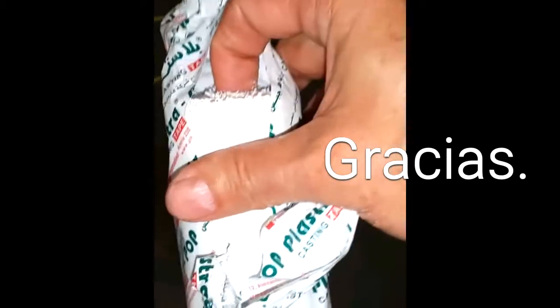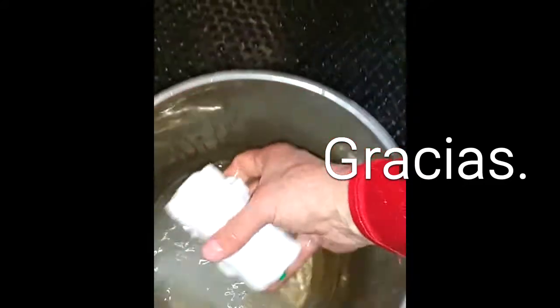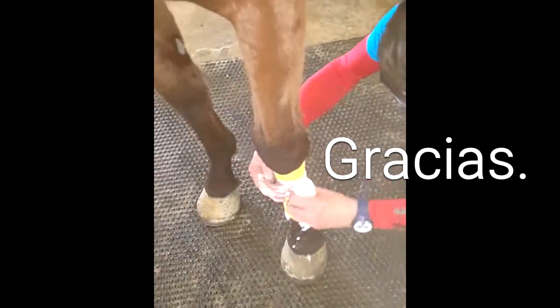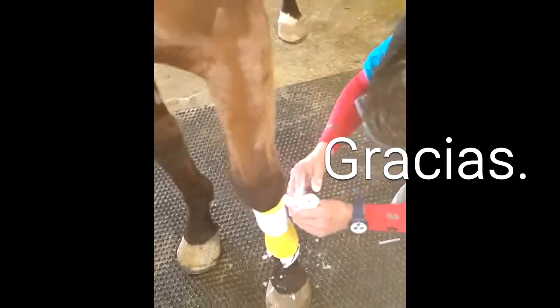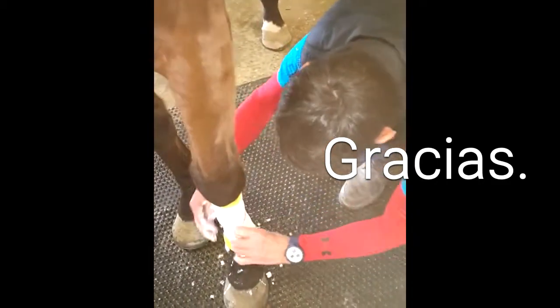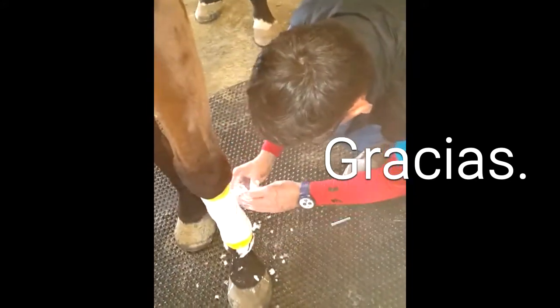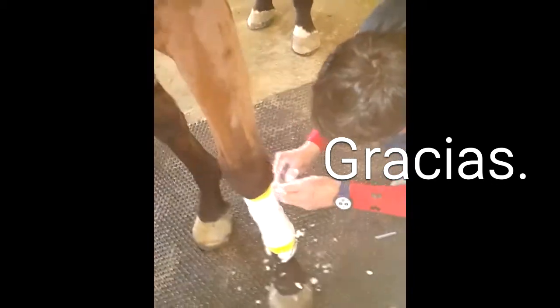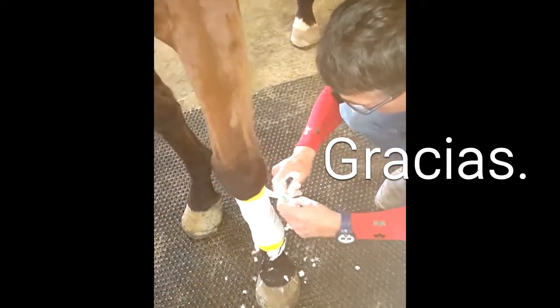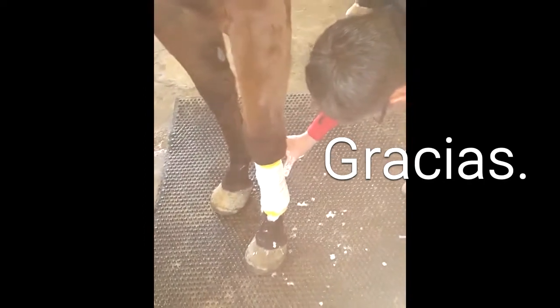Here we have a measure of gypsum. The gypsum we put in water, squeeze it one, two, three times, take it out and squeeze it again. We will start to put the cast on. I've located the damage. Never touch the skin — if not, the jips will cut the skin. After the cast, now we start to make the bandage.